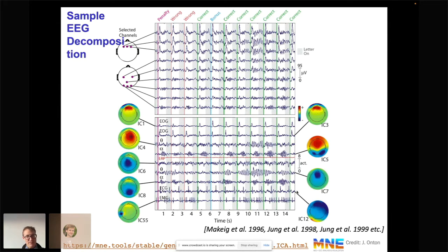So it's actually a very convincing picture showing that from this signal, where you mostly see one signal that looks completely the same for all sensors, it seems that all sensors see exactly the same thing. By unmixing them, you realize that there's much more stuff hidden behind all this.